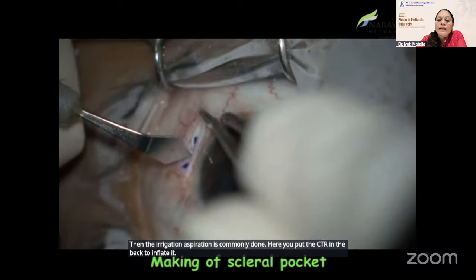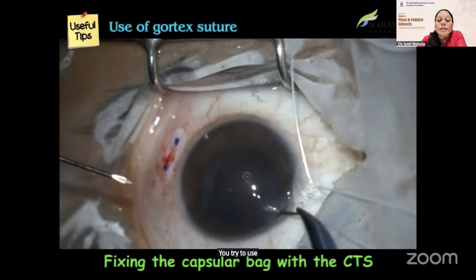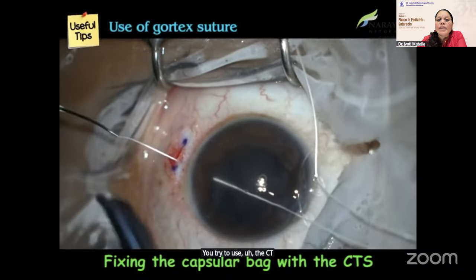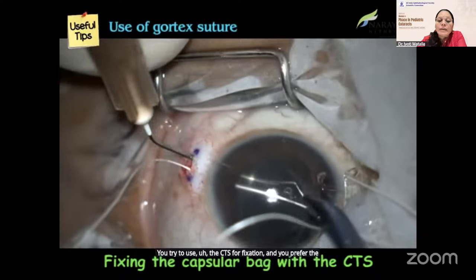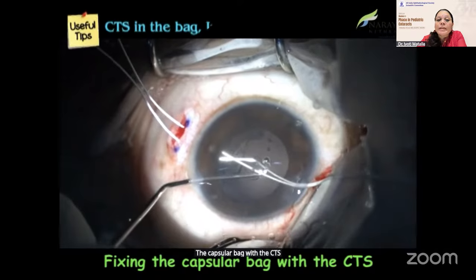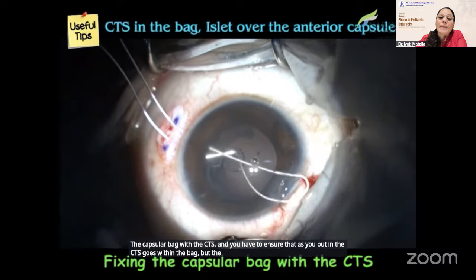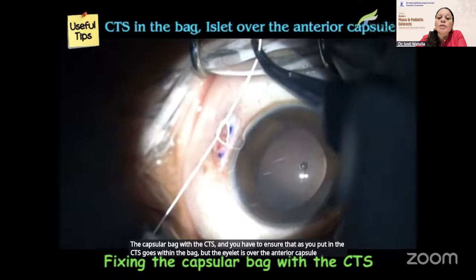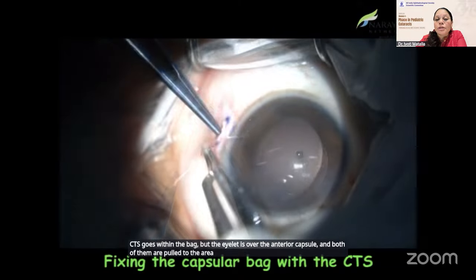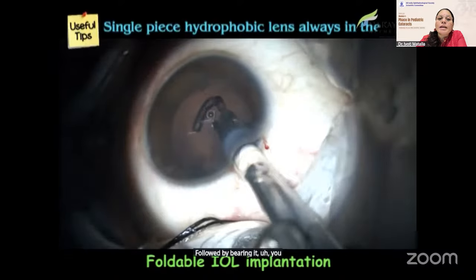Now the area where there was a maximum subluxation, you try to use the CTS for fixation, and you prefer the Gore-Tex suture here, where the capsular bag is fixed with the CTS, and you have to ensure that as you put it in, the CTS goes within the bag, but the eyelet is over the anterior capsule, and both of them are pulled to the area where there is a subluxation, followed by burying it. You use the glue to close the conjunctiva.